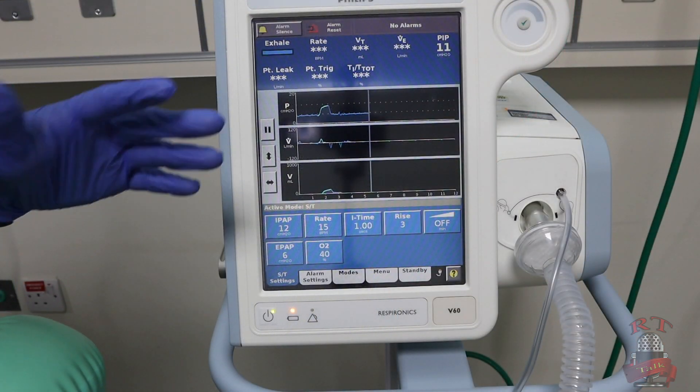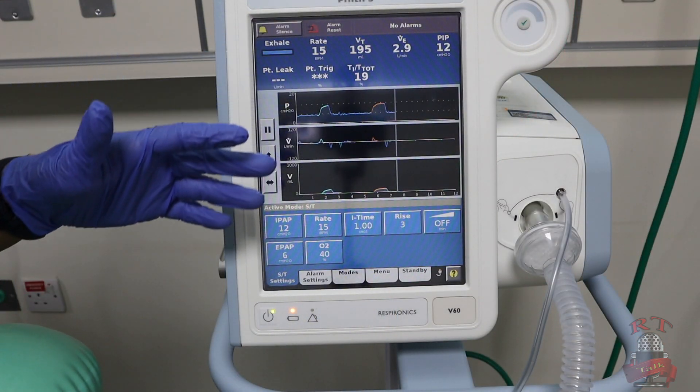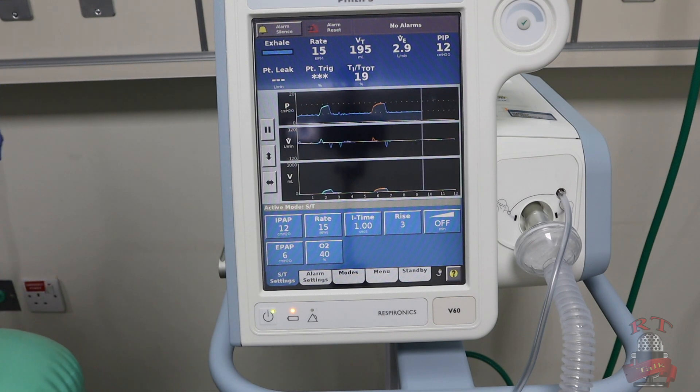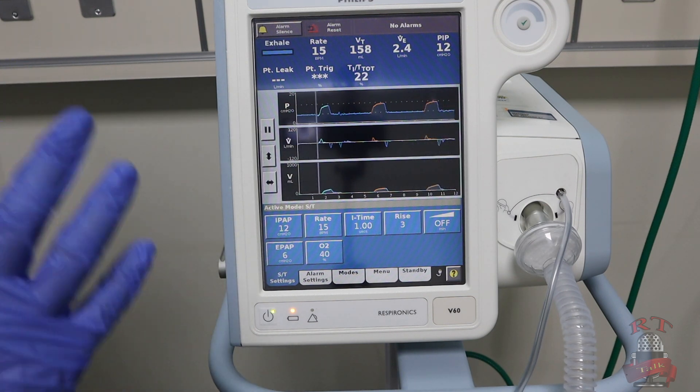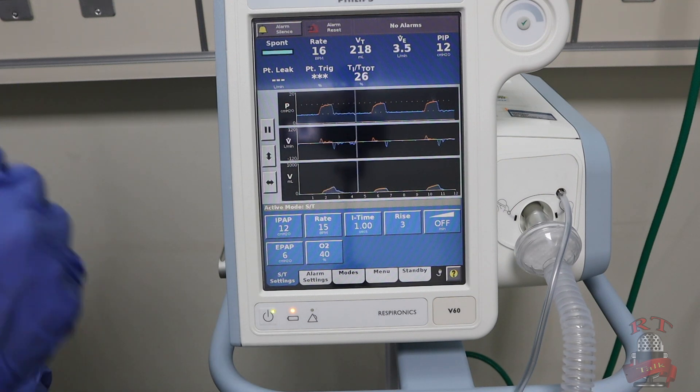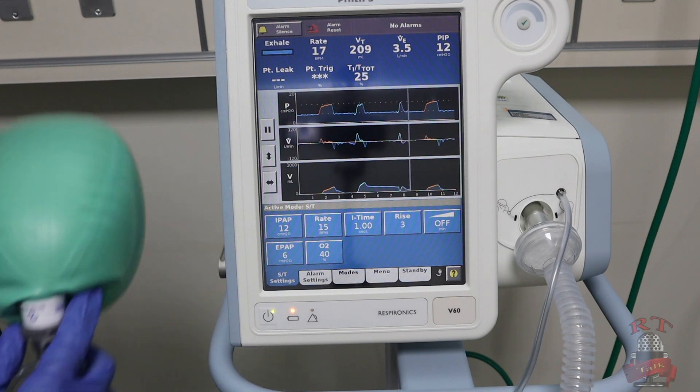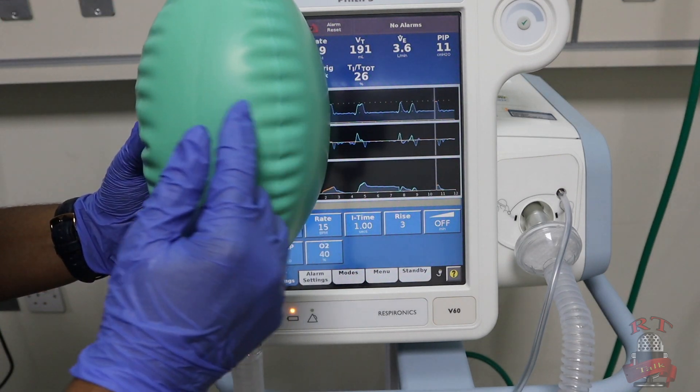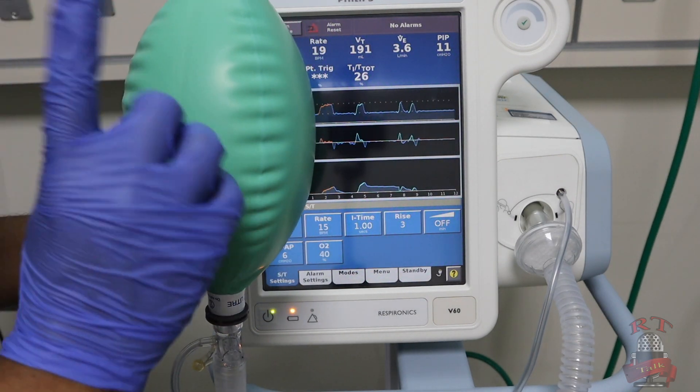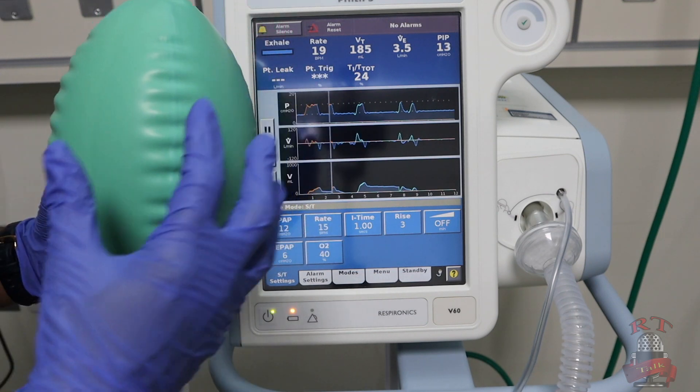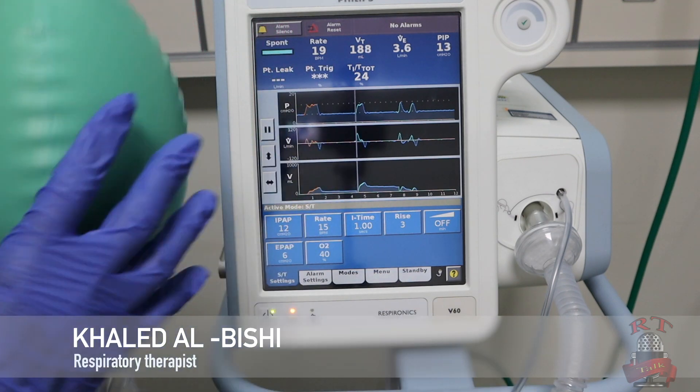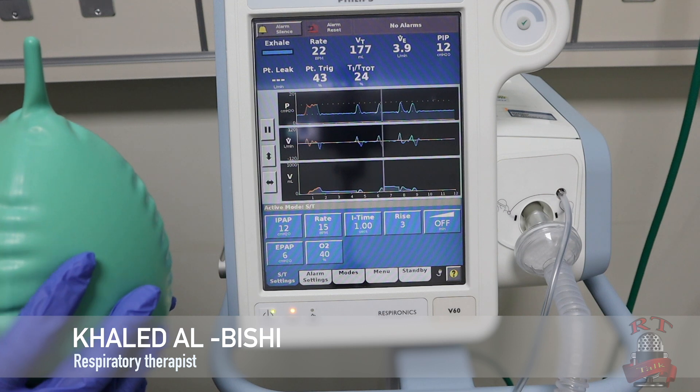So this is how we set up CPAP, BiPAP, our alarms, and our settings. Before we close this video, regarding troubleshooting—the most common problem with the BiPAP is the leak. So you will make sure that around the face of your patient there is no leak, and it's not very tight so you will not cause harm to your patient. Now you are ready to work with CPAP and BiPAP. Thank you so much.